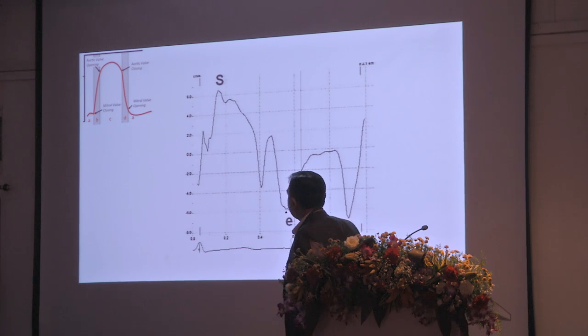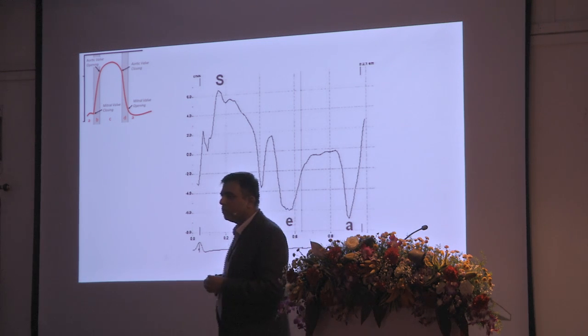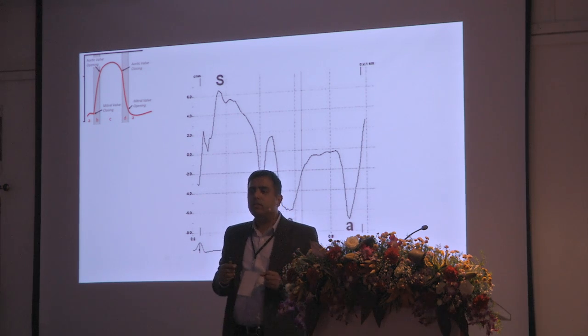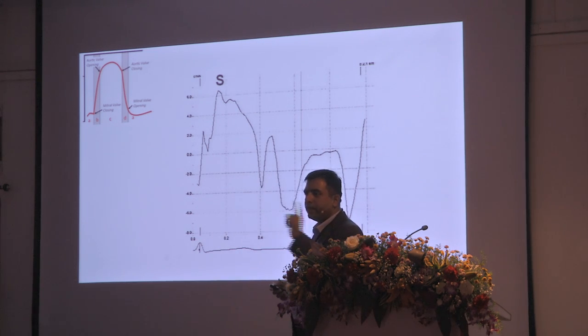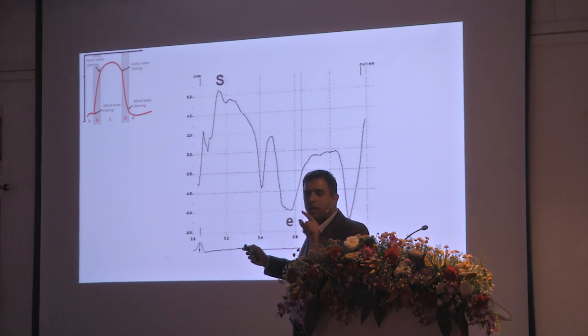So let's start off with the first part of the cardiac cycle, or the isovolumic contraction. Now, I will tell you why the term isovolumic contraction is not an appropriate word when we deal with myocardial mechanics, and we'll do that later. So my first event in my cardiac cycle is the closure of the mitral valve. That starts over here, and that marks the start of my cardiac cycle, or marks the start of systole.